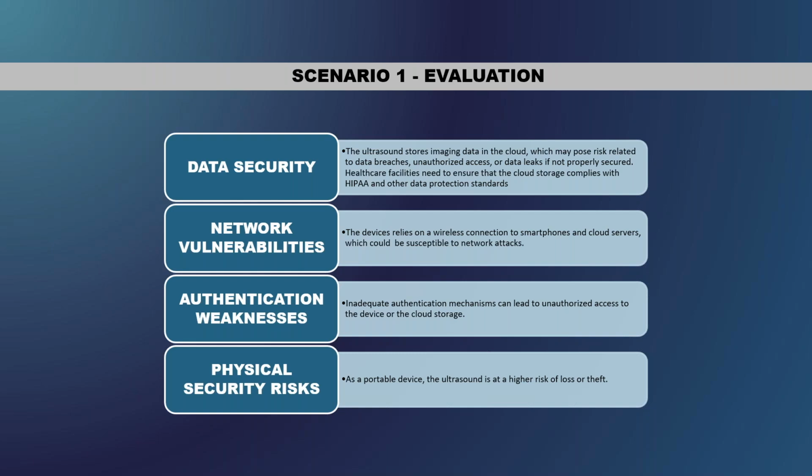Is it managed, or can we move that database on-prem so that we have control of the database versus a vendor or a cloud? The network vulnerabilities: if it's from any phone, then obviously you can't isolate it because it's not in your healthcare environment. Although it's nice for other hospitals to access that data, you can't control who has access at what time. I also talked about authentication risk as well as physical security risk, because if random phones get lost, someone might have access to that data itself.